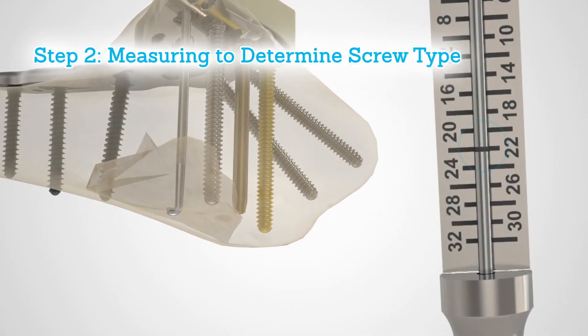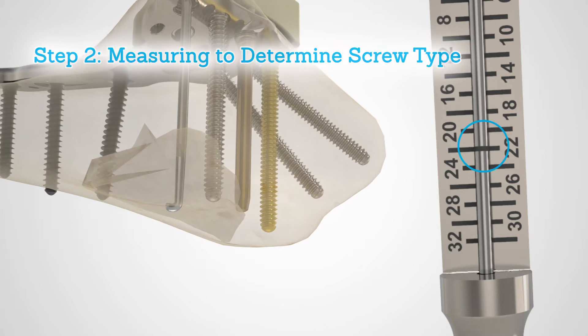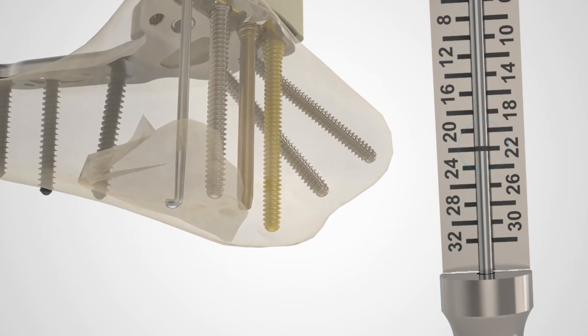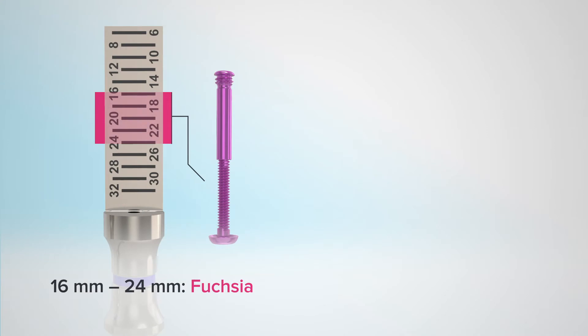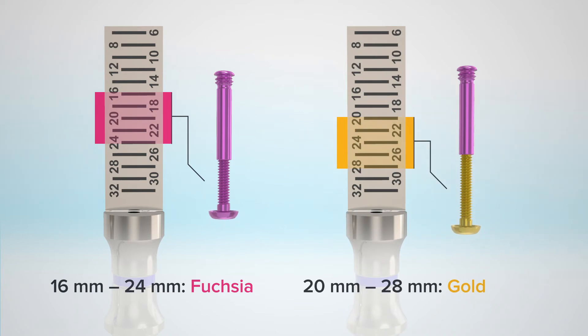If the measure is between 16 and 24 millimeters, it is acceptable to use the fuchsia-colored FragLock compression screw with the FragLock compression sleeve. If the measure is between 20 and 28 millimeters, it is acceptable to use the gold-colored long FragLock compression screw and compression sleeve.